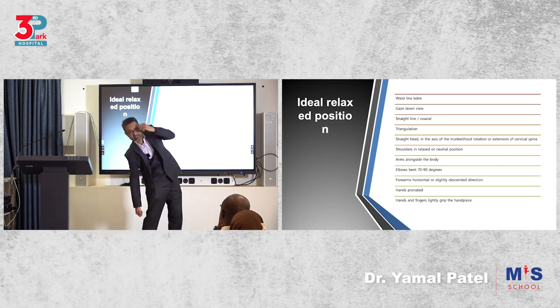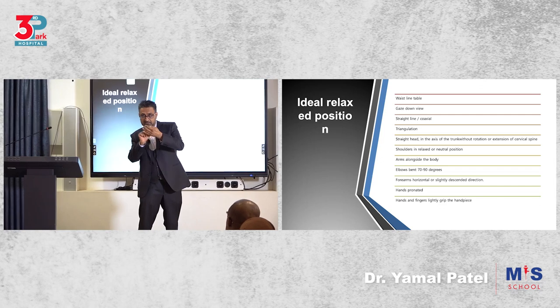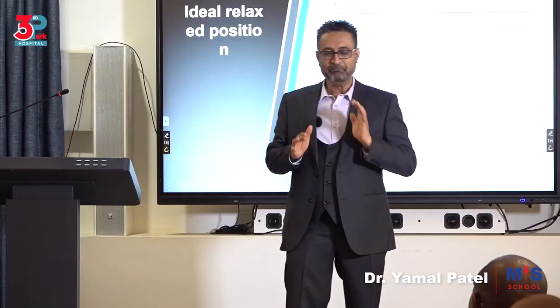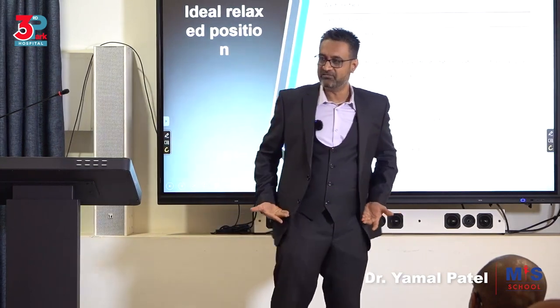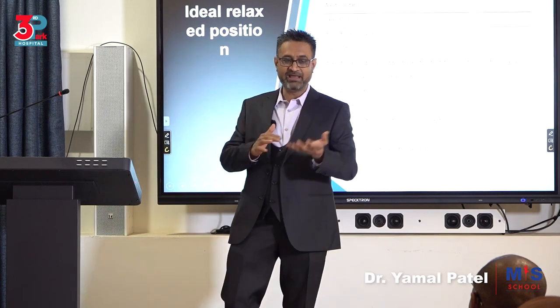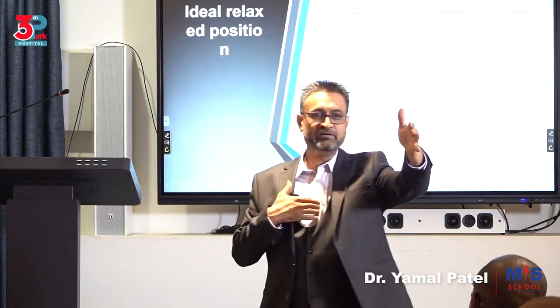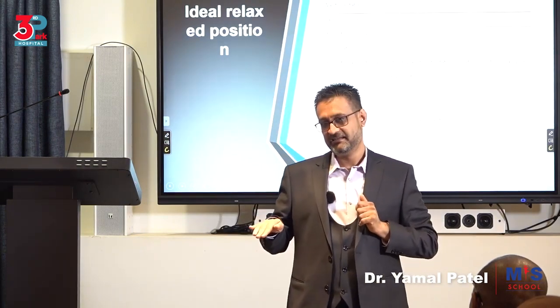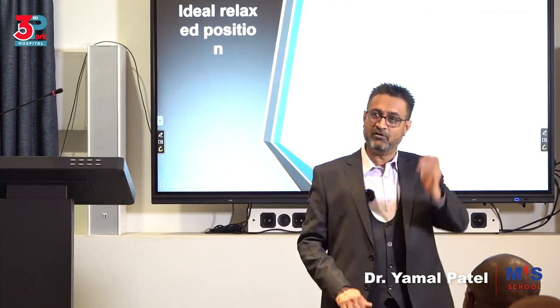So don't start measuring and then say, okay, 0.49, bring it at 98 centimeters. It's not that way, but what I meant was roughly the level of the waist or slightly below would be your table height. So what happens when I'm the surgeon and Joy, who is a very tall person there, hi Joy, yes, is my assistant. So if Joy, who is shorter than me, is my assistant, and I put it at my level, for her it might be high, so she'll be doing this.